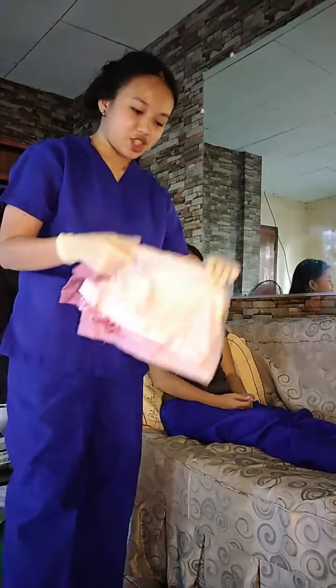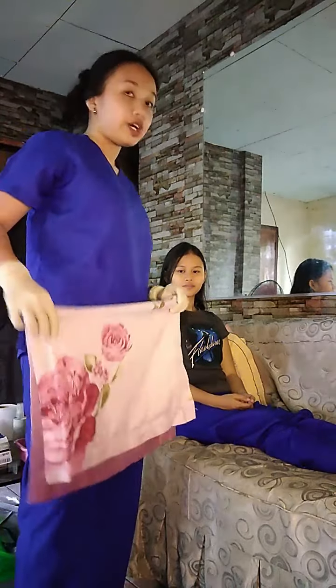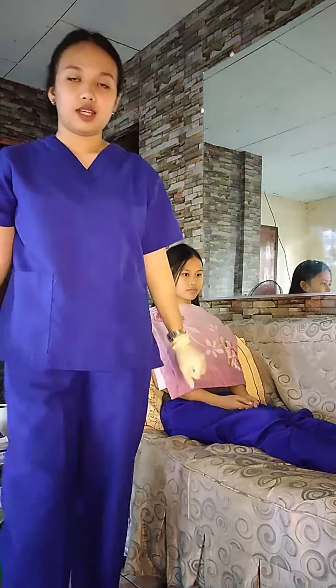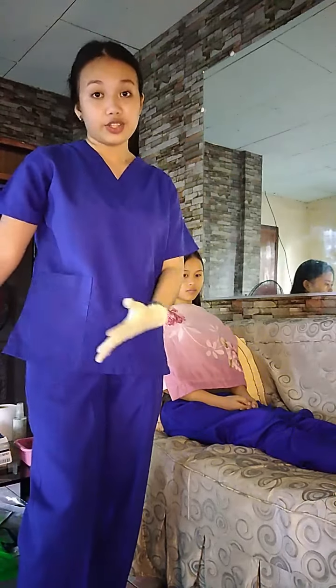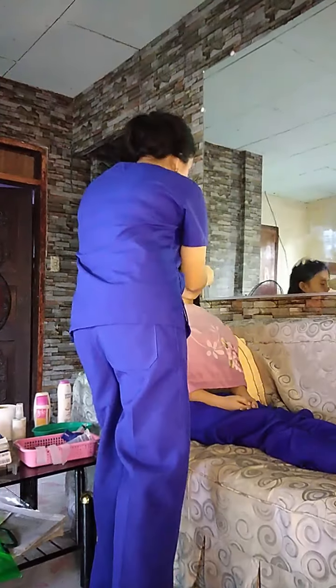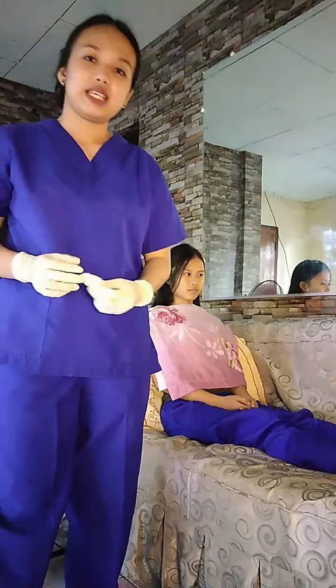And then, I almost forgot, I'm supposed to cover the chest of the patient using a absorbent pad or towel. So, ayan. So, I have covered it. And then, after ko na-identify ko na yung insertion length, i-cleanse ko na yung nose bridge ni Ma'am Cassandra. So, ayan. And then, after cleansing, I will apply skin protectant.